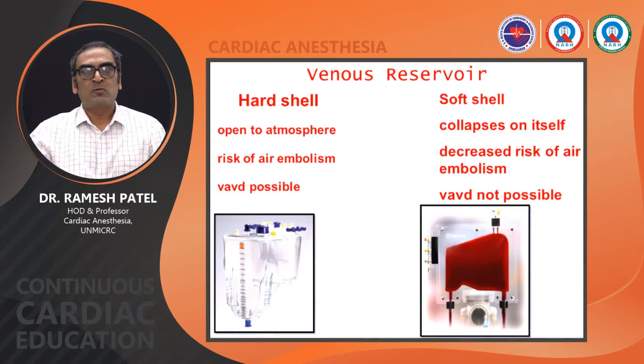Two types of venous reservoirs are available. One is hard shell and the second is soft shell reservoir. Hard shell reservoirs are used commonly nowadays. Soft shell reservoirs are not used.